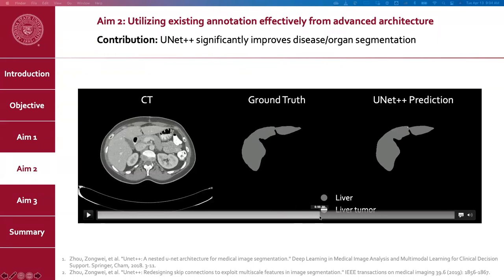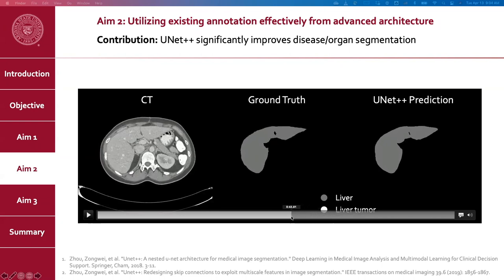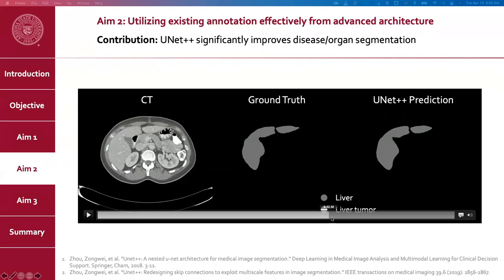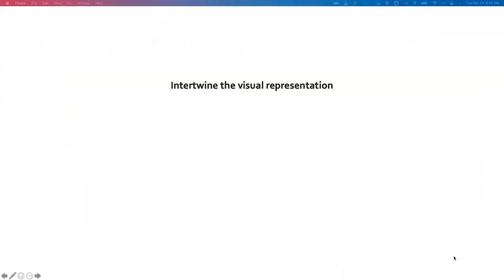These are all healthy livers and UNet++ does not generate any false positives here — though there is one false positive, but in general it's a pretty good performance. In this work, we learned that a deep neural network can extract visual representations through multiple semantic levels, and we must fully integrate each level of representation for a more precise and comprehensive result.